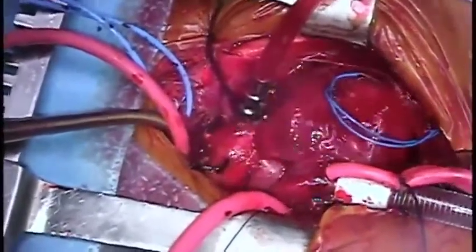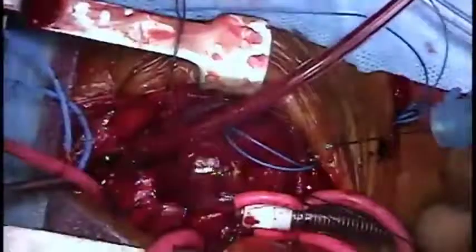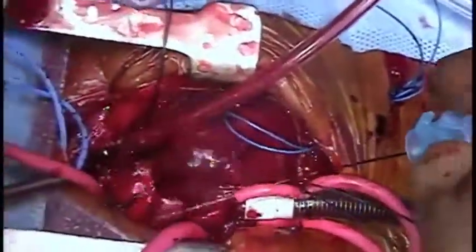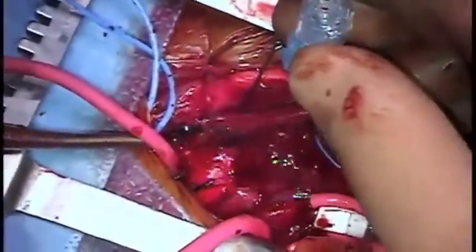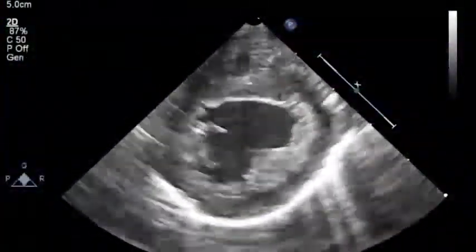The heart is now beating well, allowing the patient to be weaned from cardiopulmonary bypass. The right ventricular pressure is measured by direct puncture and found to be around one-third systemic. Modified ultrafiltration is undertaken and an epicardial echo is performed.